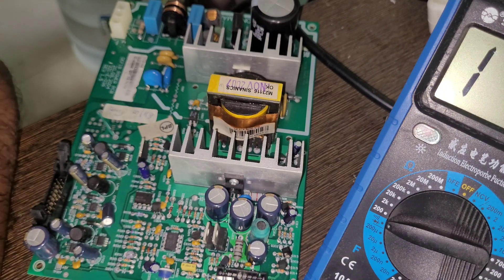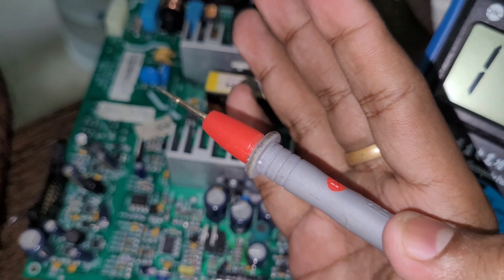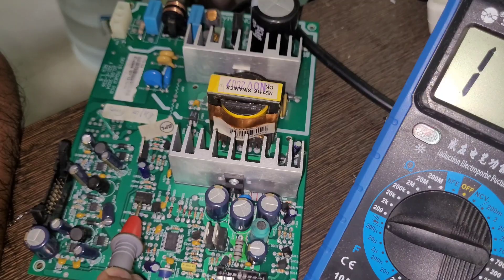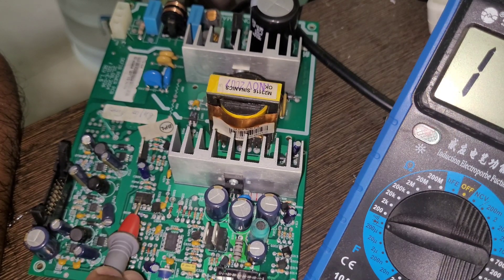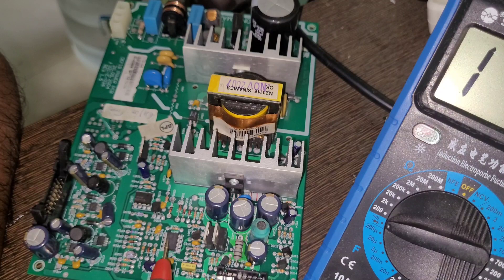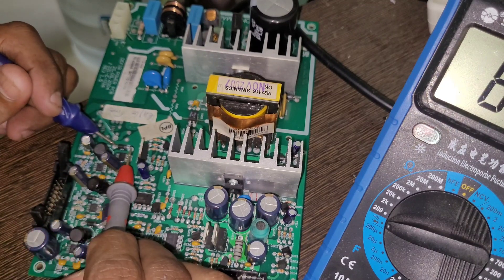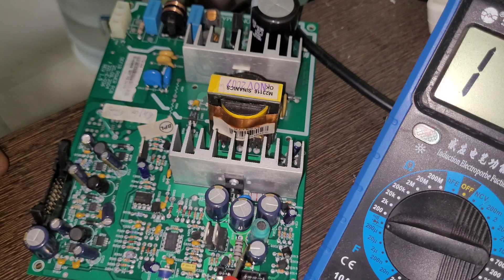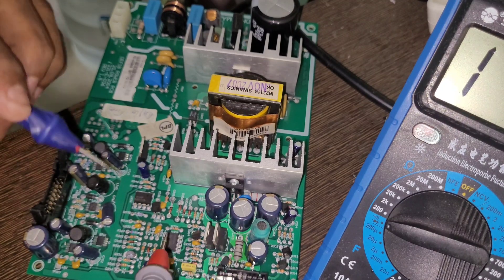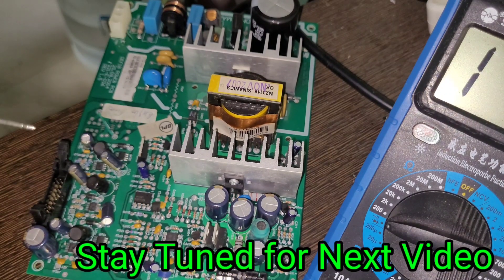In electronics service, the formula is simple: if you have a doubt about a particular component, you change it and check the output. So we can change this IC — if the output is coming after the replacement, then we can confirm that IC was faulty. Otherwise, we find another way to identify the faulty component. Since there's no visible problem with the MOSFETs, transistors, diodes, resistors, or capacitors, I'm going to replace these two ICs and figure out whether the problem is resolved.